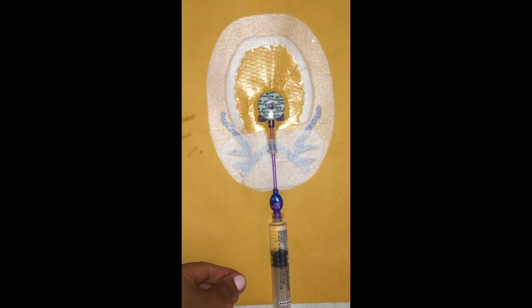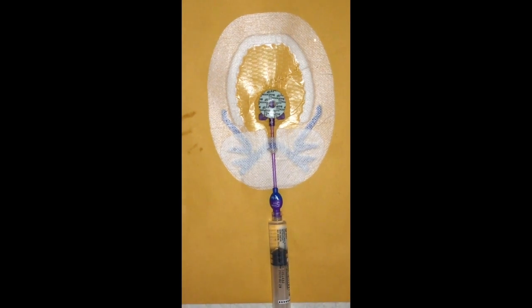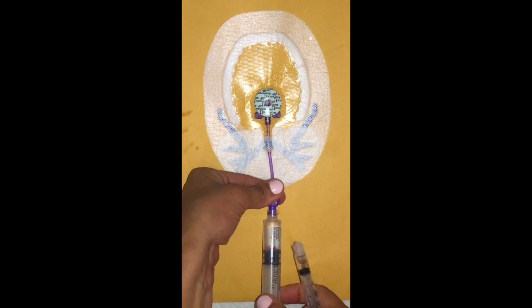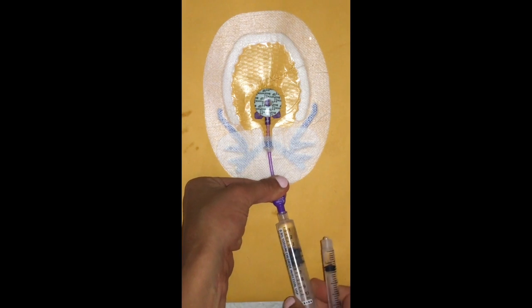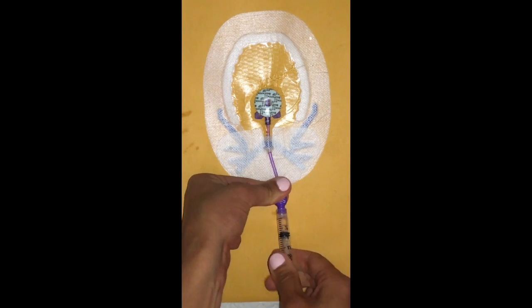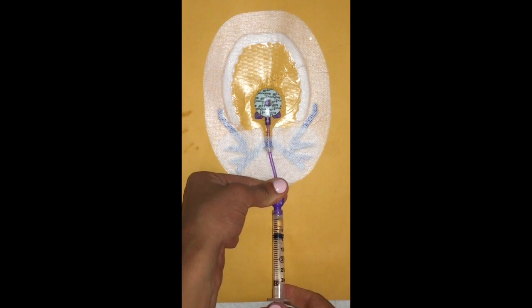So once you've drawn up that volume, it's your prime volume. It's 80% of your dwell. Again, that's so you don't bolus the patient. That's why we use 80%. So you're going to disconnect your flush. You're going to attach your prime volume. And you're going to slowly instill that into the line.